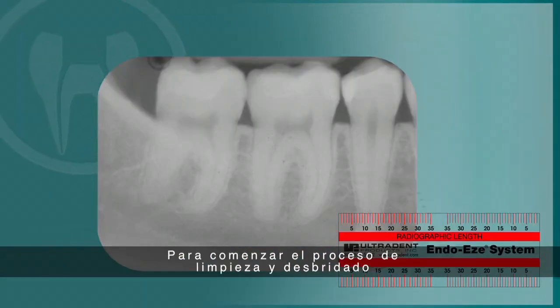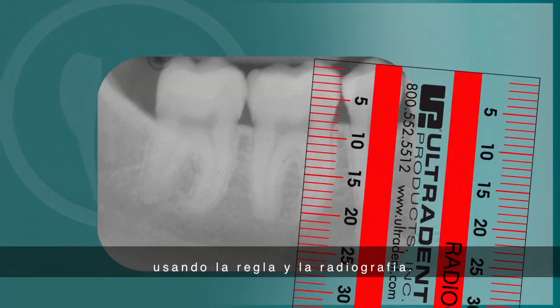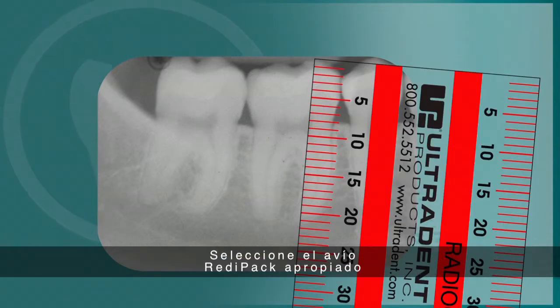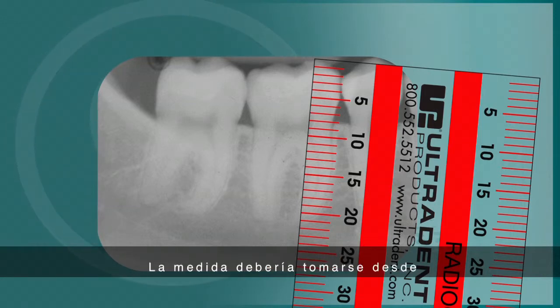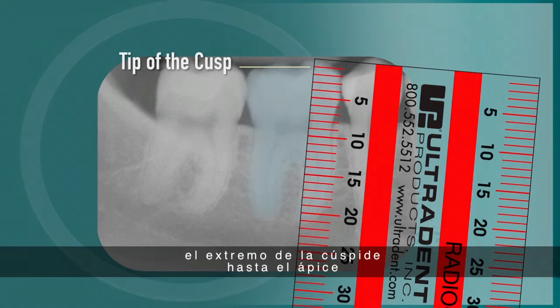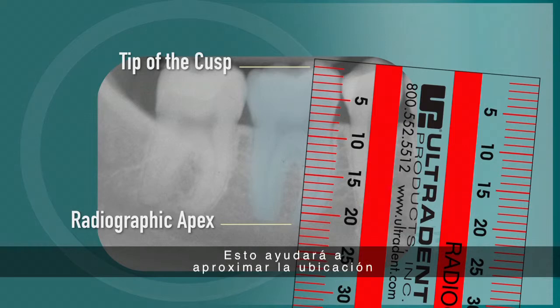To begin the cleaning and debriding process, start by measuring the length of the tooth using the endo ruler and the X-ray image. Select the appropriate Ready Pack file kit according to this measurement. The measurement should be taken from the tip of the cusp to the anatomical radiographic apex of the root. This will help to approximate the location of the apical foramen.